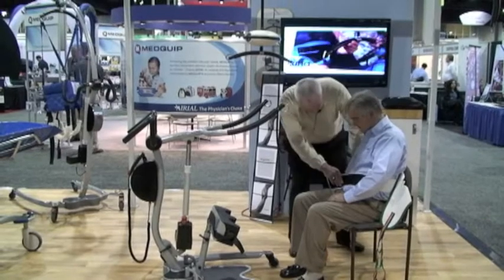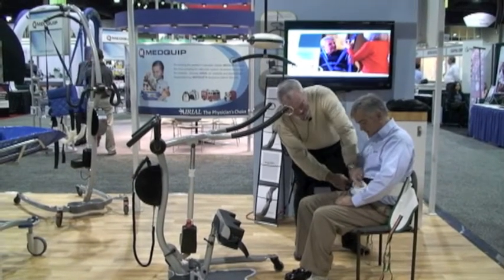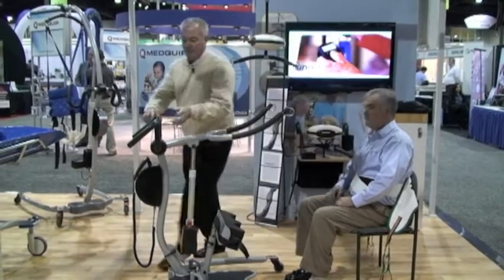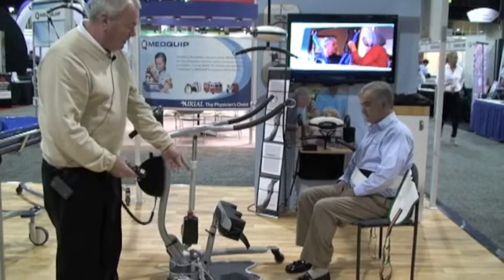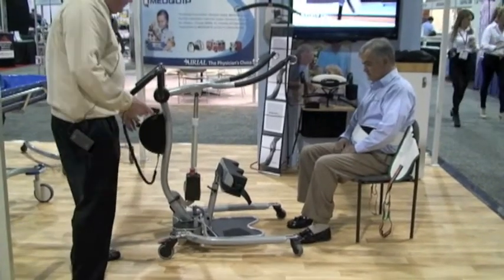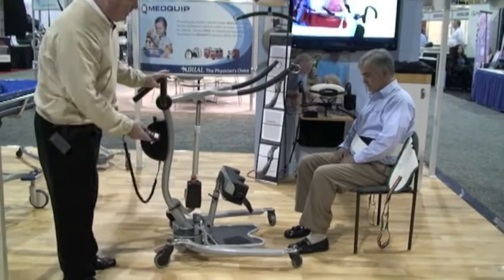I don't want to make it too tight. This particular lift has legs that open up so we can get around wheelchairs. As you can see here, the legs open up to allow proper positioning around the wheelchair.